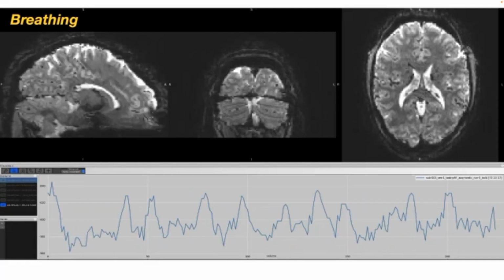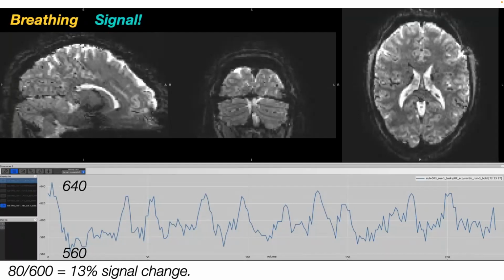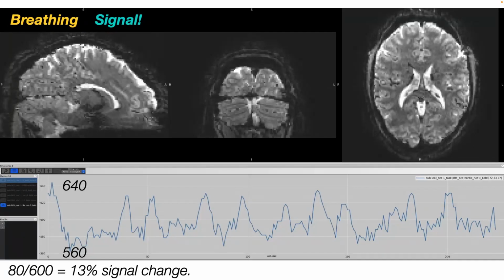There's one thing that I was interested in, and that was this flickering bar that was on the screen 8 times during this experiment. I think it was, maybe 9, I forget. And this is just here to give you an idea of the percent signal change that we might experience, right? You've seen all of this noise, right? The time courses that you see here at the bottom, I hope that was clear, I forgot to say. But it was clear that for every voxel that I select here, we're looking at a time course, yeah?